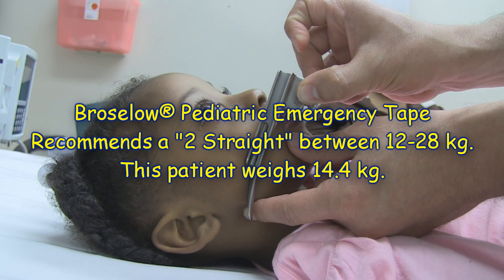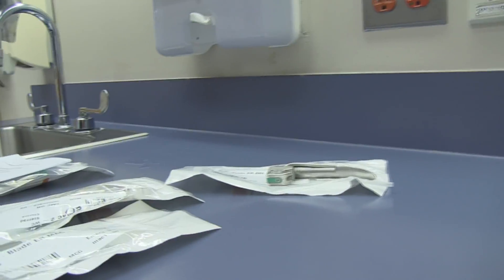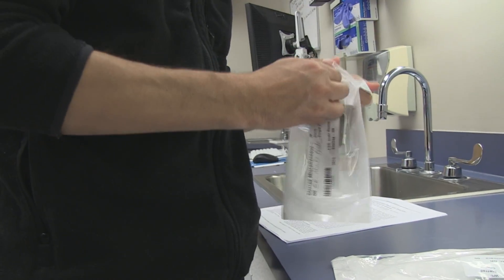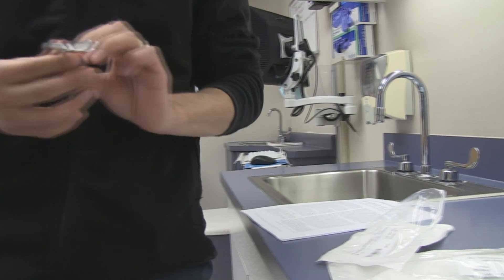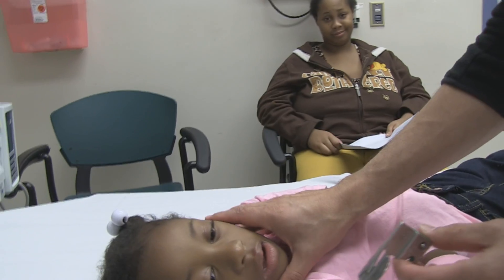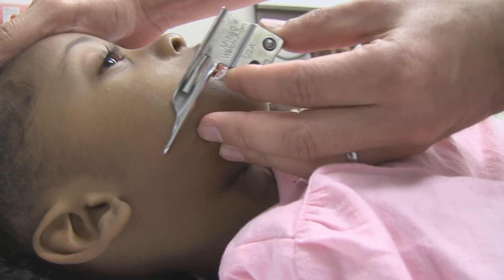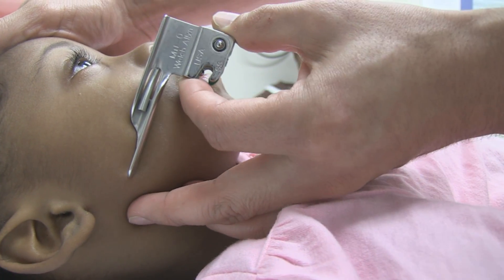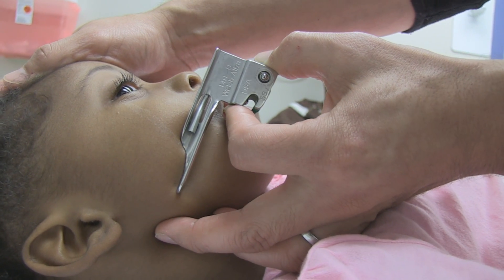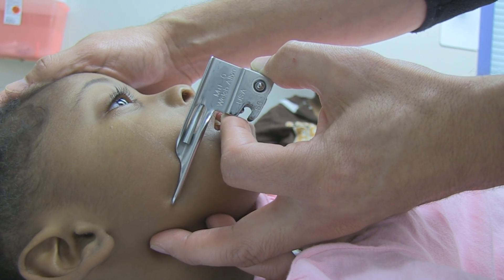Now let's open up the Miller Zero and see if that would work on her — that was actually the initial best guess. The Miller Zero is typically grabbed for a very small baby. Again, the base of the laryngoscope blade is at about the level of the central incisors, with my finger at the level of the angle of the mandible. The guidelines say within a centimeter in front or a centimeter behind. This one looks about 1.5 centimeters too short.